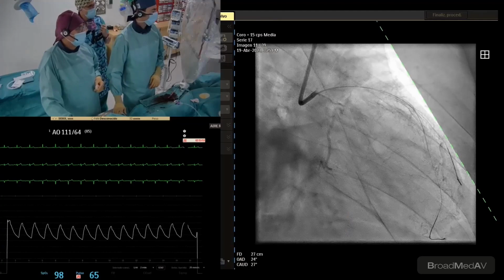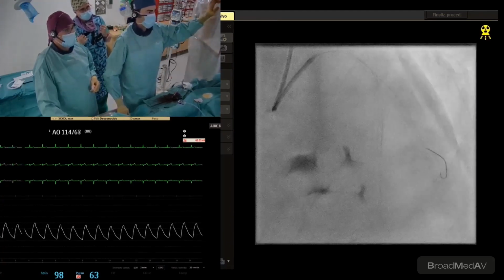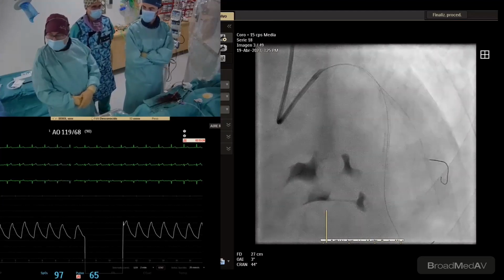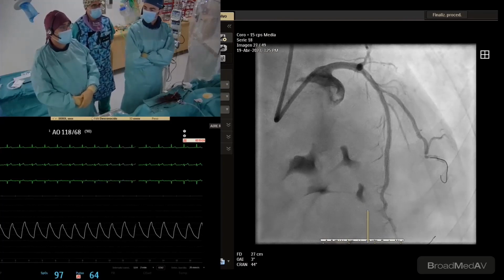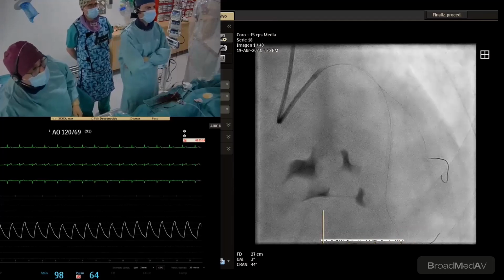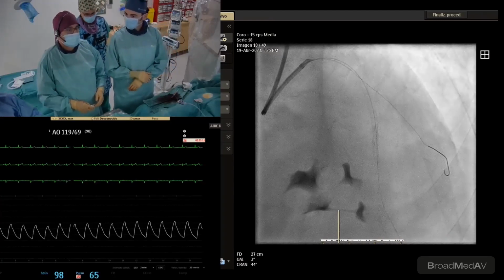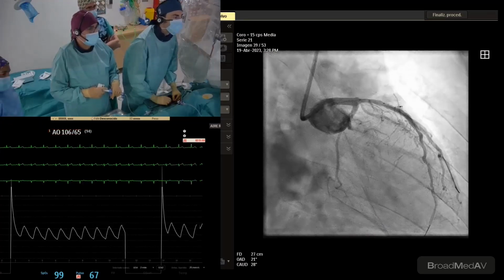As you have seen, the patient also has a coronary occlusion in a branch of the circumflex that is a small vessel that we are going to treat today. We're going to use an Orsiro stent, 3.5 by 13. It's an ultra thin strut stent, not in the 3.5 diameter, but a thin strut sirolimus eluting stent. So probably we can put a stent in this projection and then go to the caudal to confirm. A lot of movement. Yes, I think so. It's okay, no?